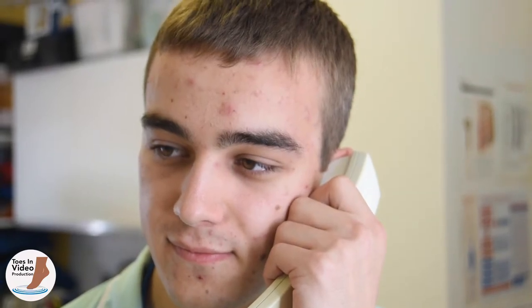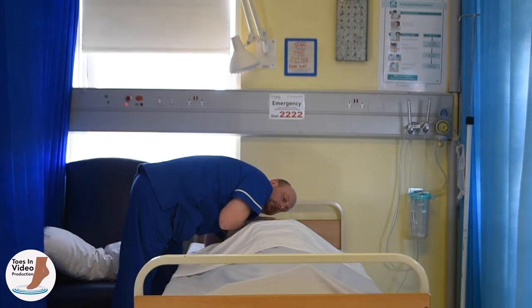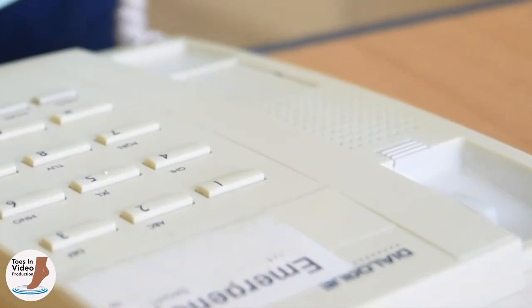Ensure the switchboard operator repeats the message back to you before terminating the call. If you're in the community or outside of hospital buildings on the St Mary's site, instruct them to make a 999 call to ambulance control. If you are using a mobile phone to call 999, activate the speaker mode and place it next to the patient as you begin CPR. If you're on your own with an adult patient in cardiac arrest and have to go to a telephone to make an emergency call, leave them at this point to make a 2222 cardiac arrest or 999 call.